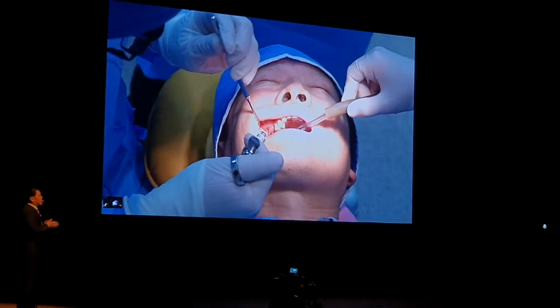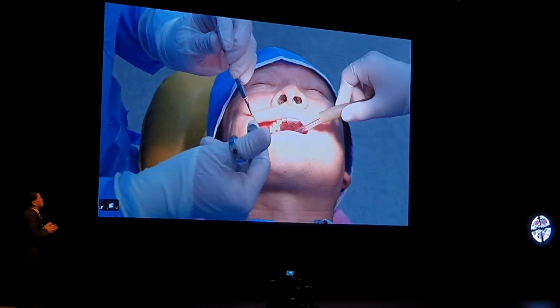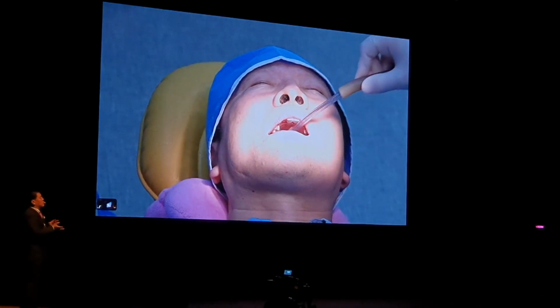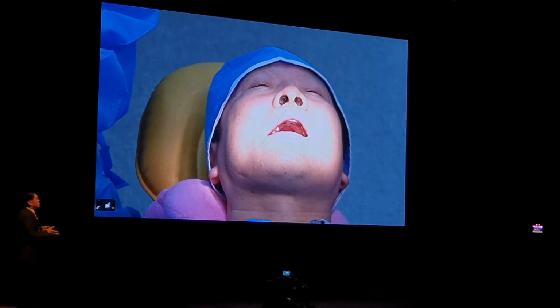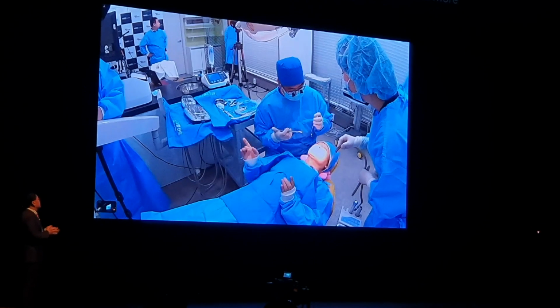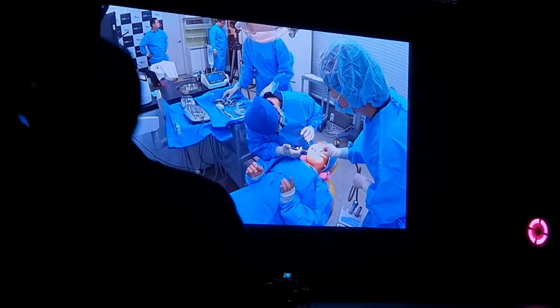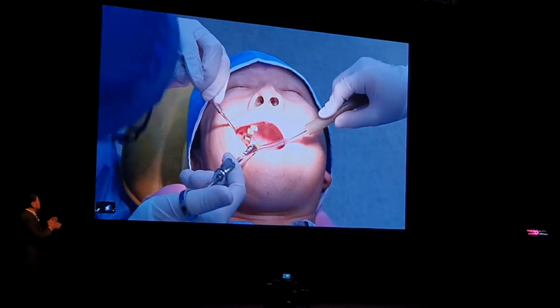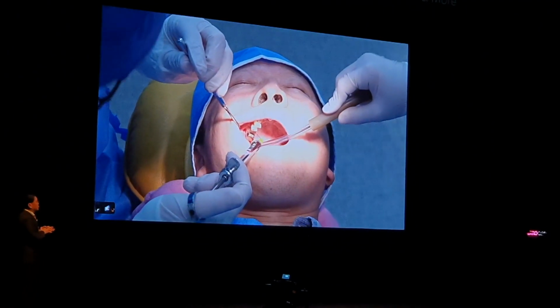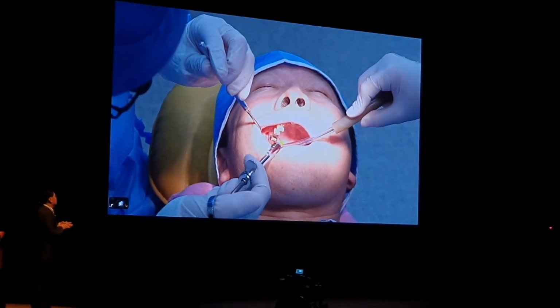In the meanwhile, I'd like to briefly share my experience with the VARO guide. In Korea, elderly people are covered by government implant insurance, and quite a number of them often refuse to have bone graft. So in such a case, the advantage of using a guide is that we can plan the implant position precisely in between bones. This way we can place the implant without the bone graft.